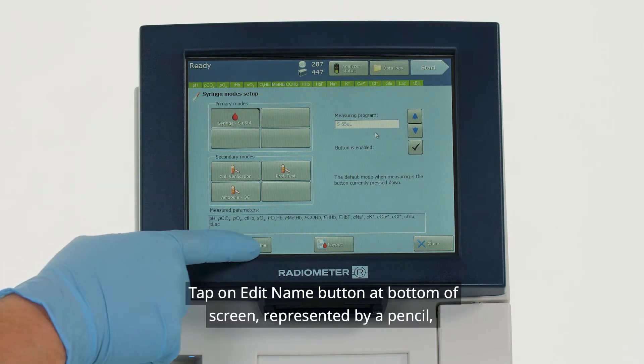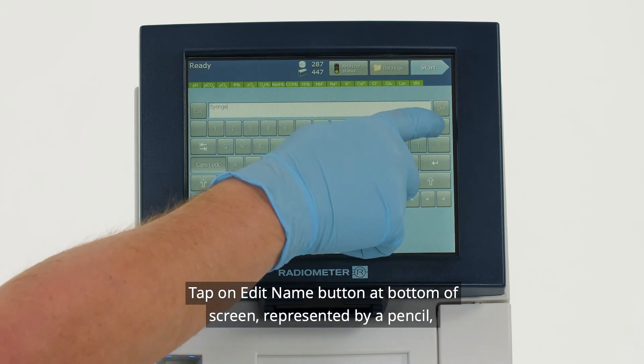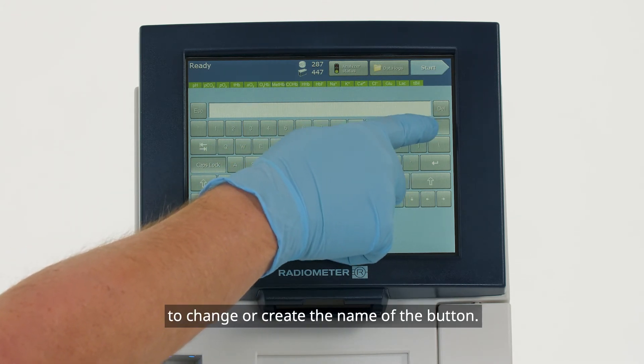Tap on the Edit Name button at the bottom of the screen, represented by a pencil, to change or create the name of a button.